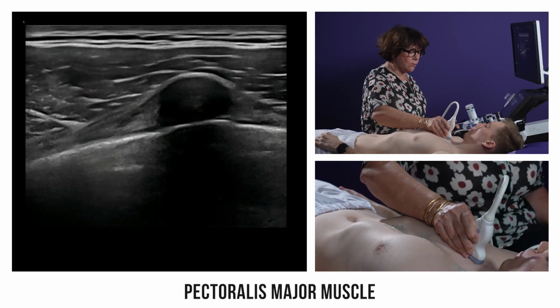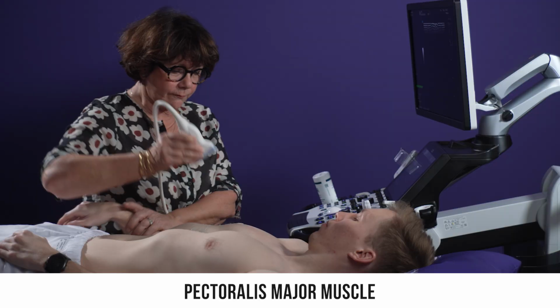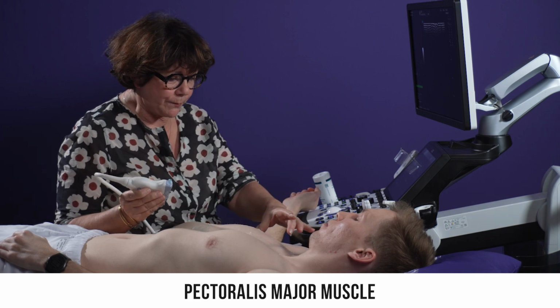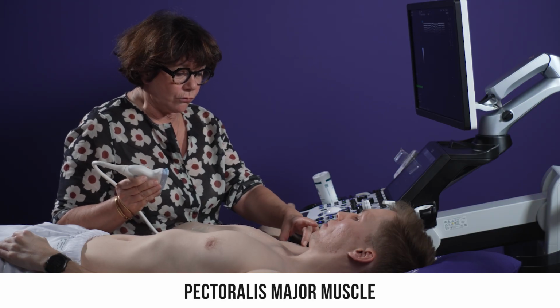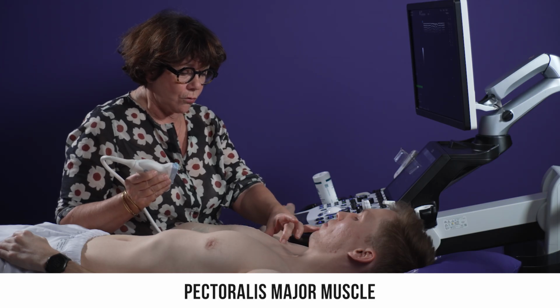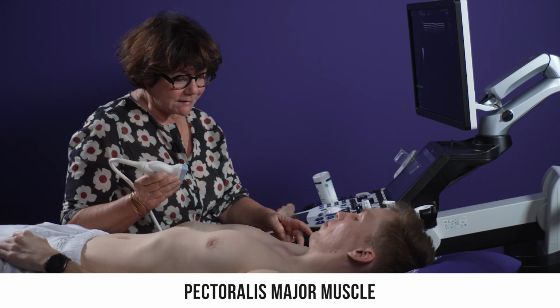Let's now explore the lateral portion of the pectoralis major. To clearly visualize the lateral insertion of the pectoralis major, we ask the patient to abduct their arm, which allows us to see the lateral part and the tendon inserting into the bicipital groove.